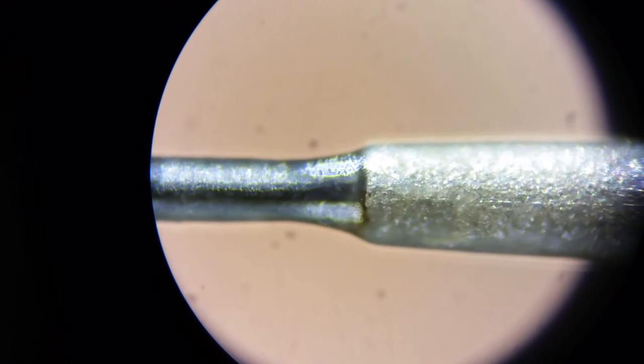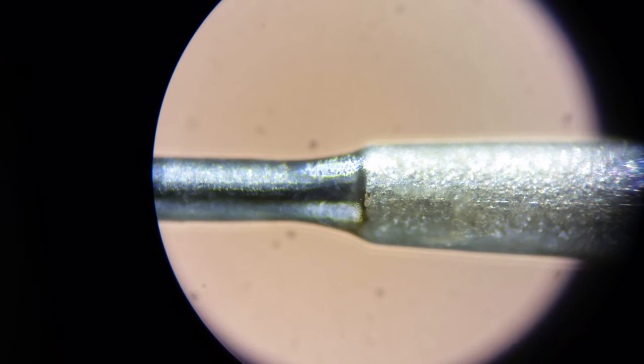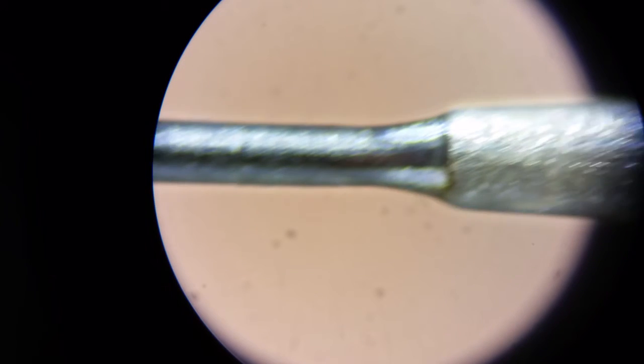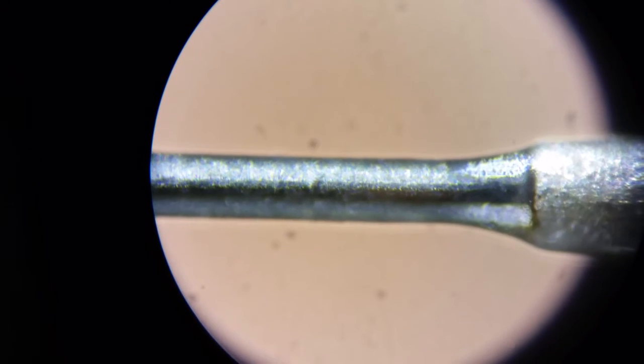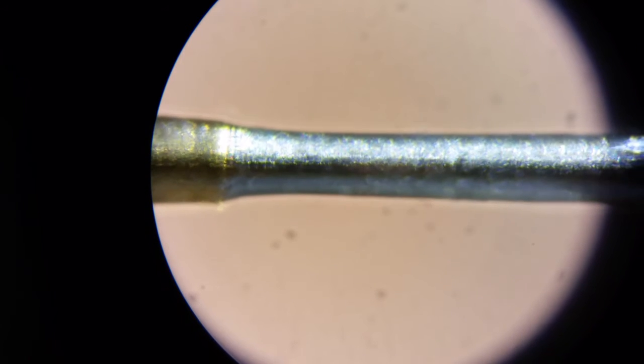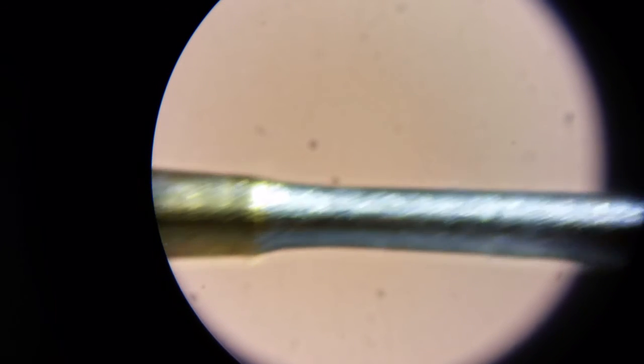So you can see this transition from where it goes from encased in what I assume is a non-conductive sheath of some kind to bare metal. And then if we go out further, we'll notice that the coloration changes.